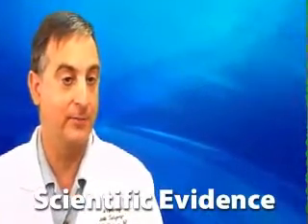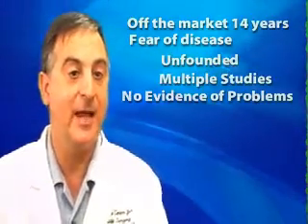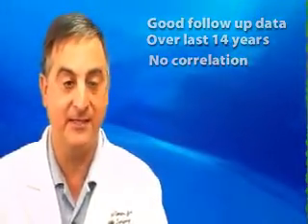Well, what does the scientific evidence show us? The gel-filled implants were removed from the market 14 years ago. This was due to potential fears of a relationship between the implants and certain autoimmune and connective tissue diseases such as rheumatoid arthritis and lupus. Good follow-up data over the last 14 years has shown no correlation between gel-filled implants and these diseases. The FDA has deemed the gel-filled implants safe and effective, that is, they do what they are intended to do.